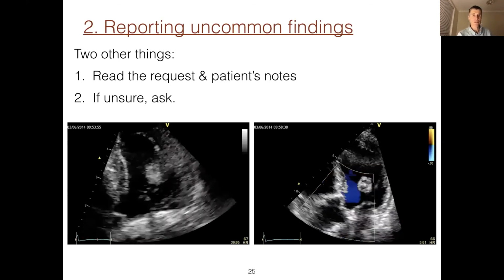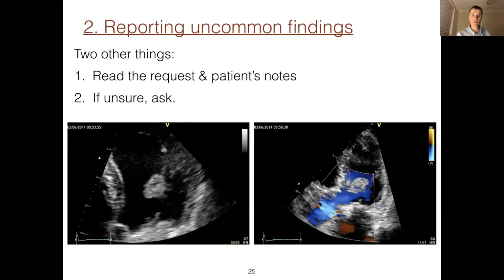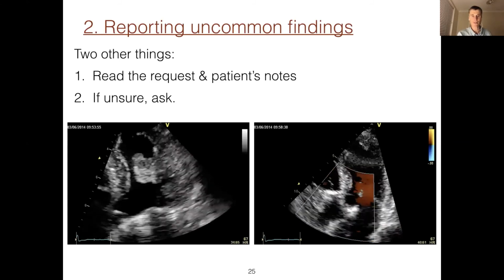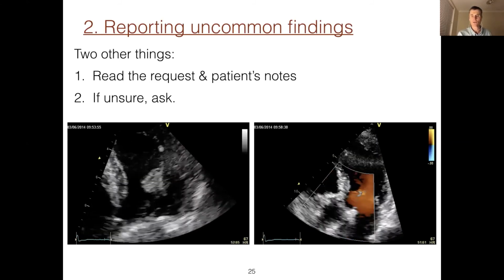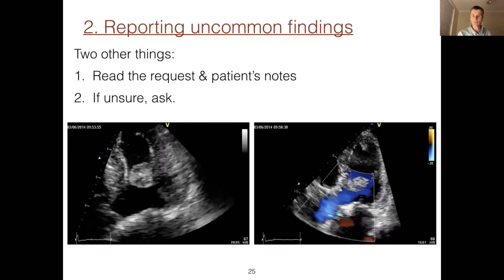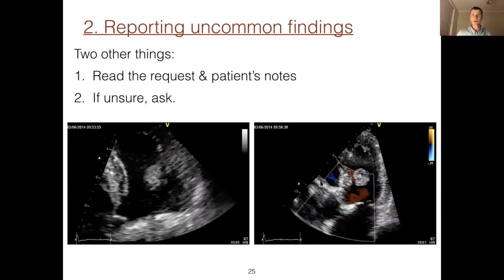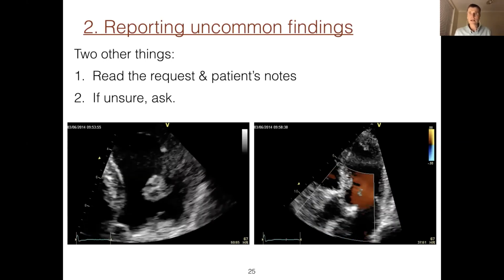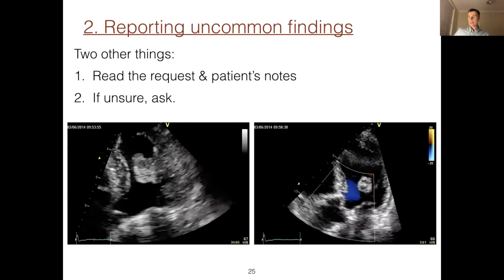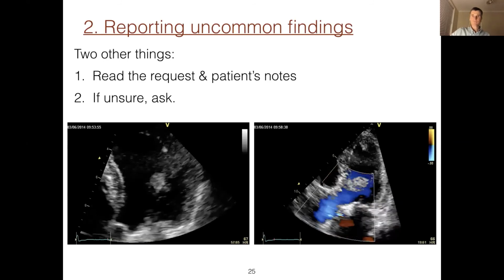The patient was asked if they wanted this lesion removed, but because of significant other comorbidities, chose not to have heart surgery. So each time, it's just a matter of getting some really impressive images and working out whether or not they are similar to previous ones. And that leads me to my last point.